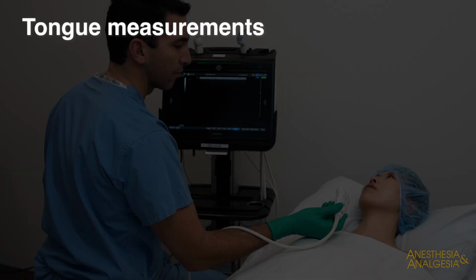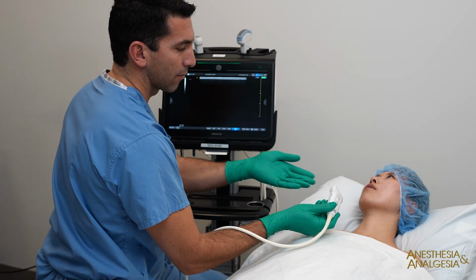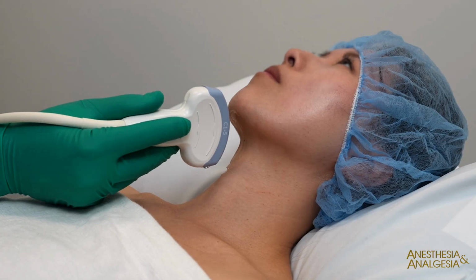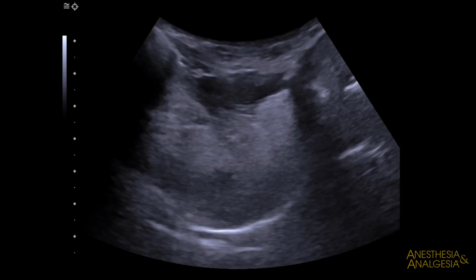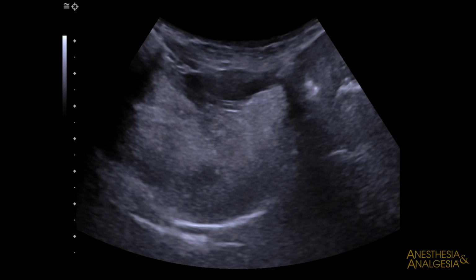Tongue measurements, including thickness, area, and volume, can predict difficult laryngoscopy. Tongue measurements can be performed with either the linear or the curvilinear probe. Place the probe in the sagittal plane, centering the image of the tongue on the screen.